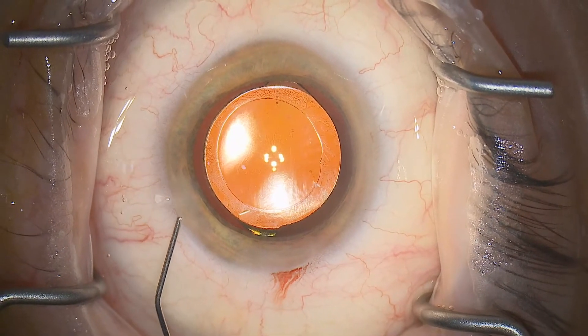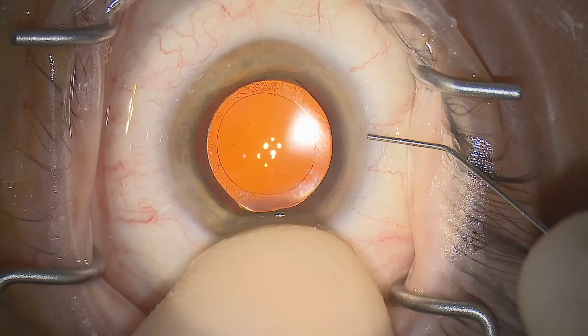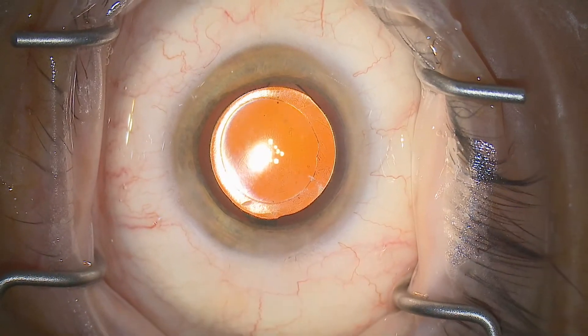Looking again in slow motion: that's floating just into the entry site as we inject — a real light touch — not pressing down, and then advancing further into the eye to allow fluid outflow.